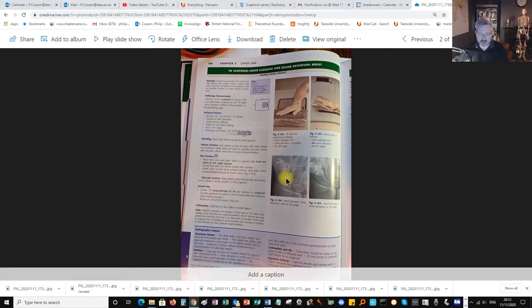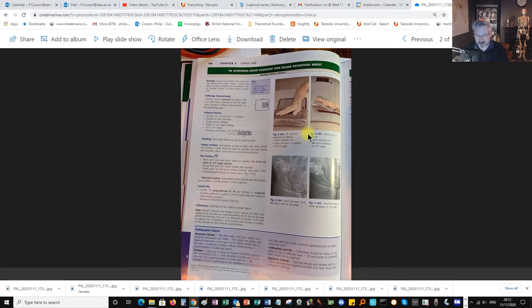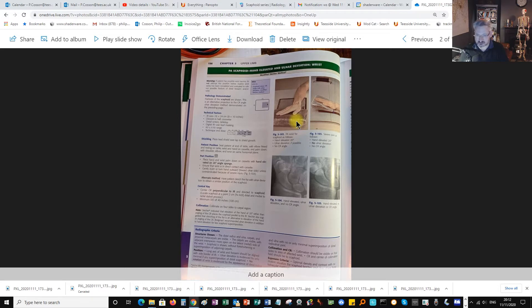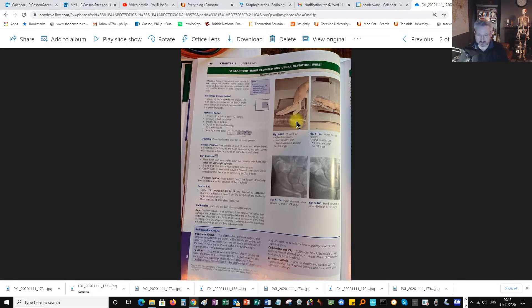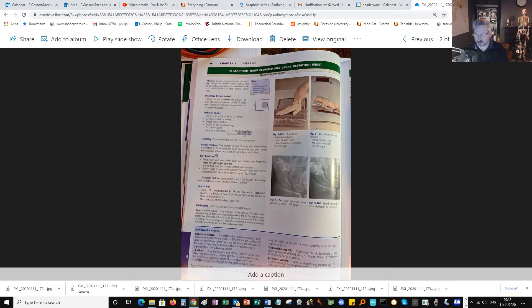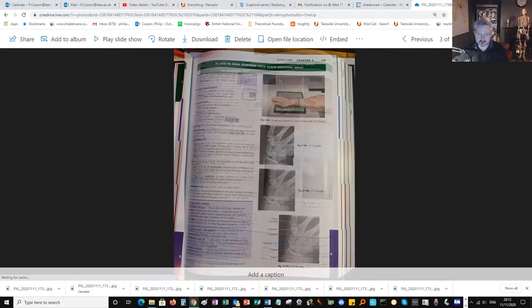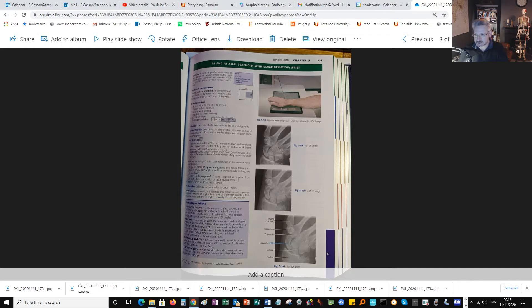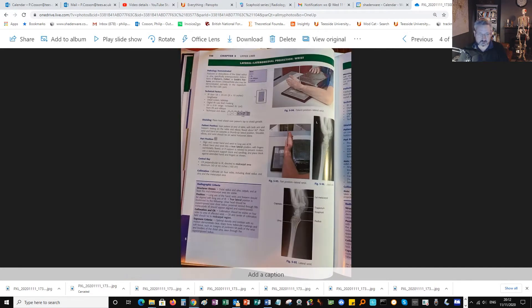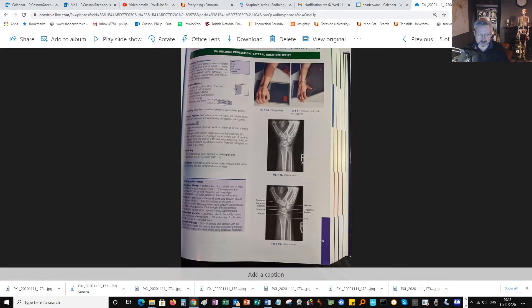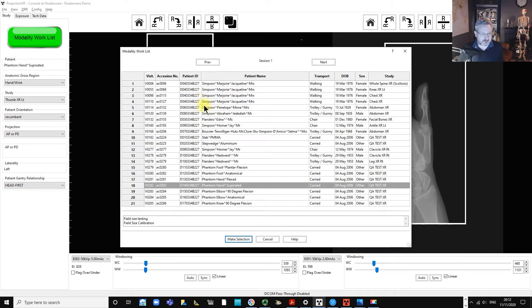In this video we're going to look at what's called the scaphoid series — the various projections taken to do a full survey. There are four projections: the standard dorsi-palmer projection of the hand and wrist, a specialist angled projection of the dorsi-palmer hand and wrist, the lateral, and the oblique, not necessarily in that order.